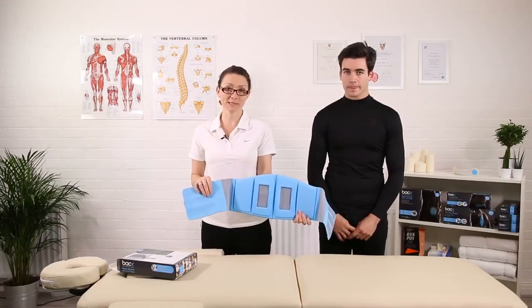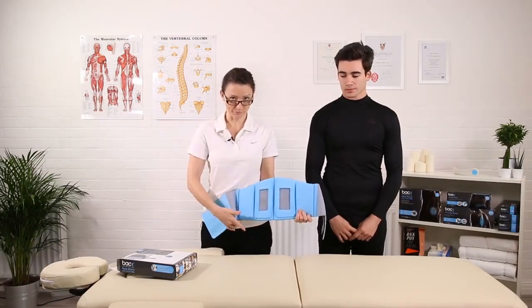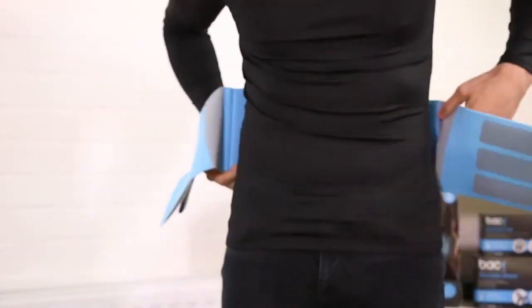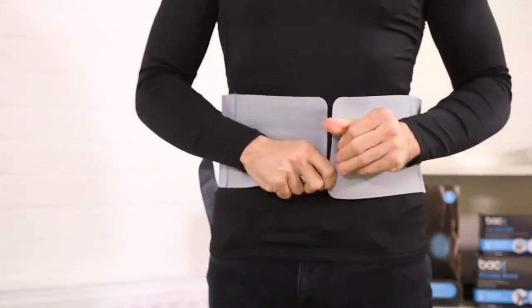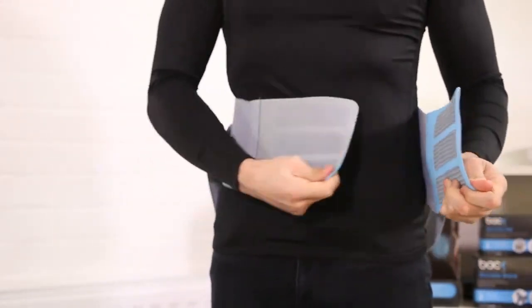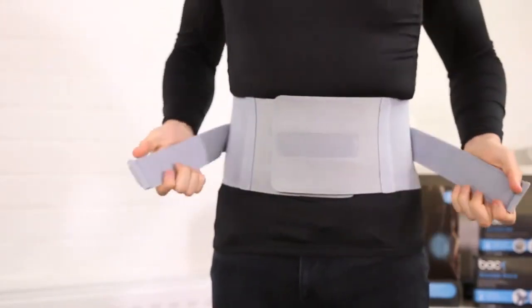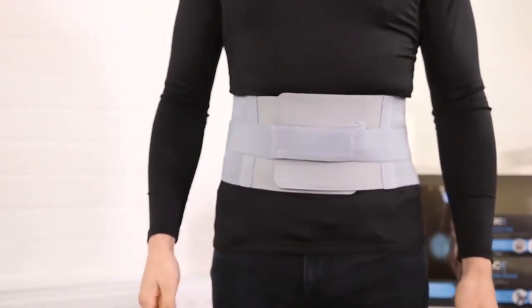Now the brace is ready to fit — it's very simple to put on. You basically put it on like a belt, with the flat section towards your bottom. Pop it around your waist and peel off the small straps. Now you can position the large belts around your waist for comfort and fit.